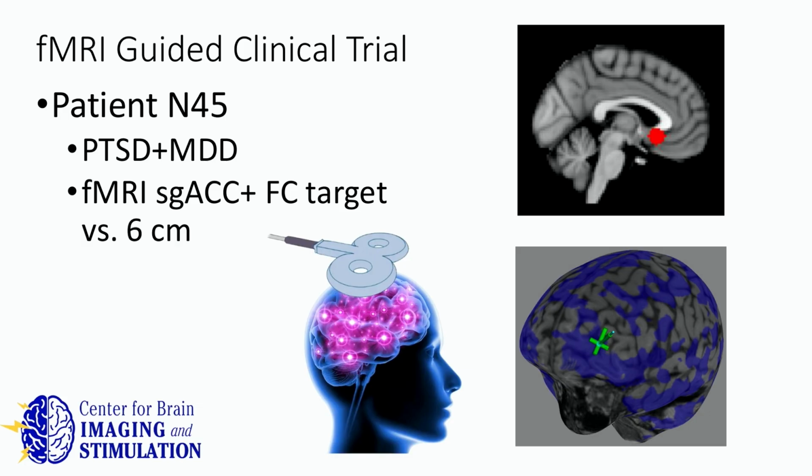So on the clinical side first, to show that fMRI-guided TMS is actually clinically useful, I think our assumption is that yes, it is, but as some other folks mentioned, it's important to have the right target. And when I say the right target, that is something that justifies doing the image guidance. It doesn't mean that I have found the ultimate best target for treating a disorder, but having this comparison with a scalp target, which is obviously much quicker and easier to do.